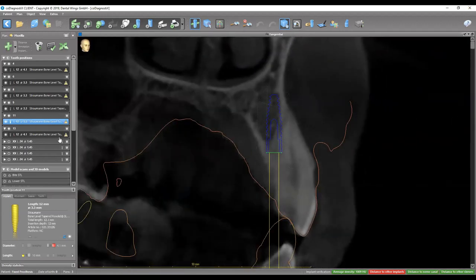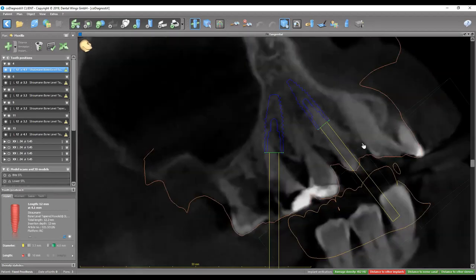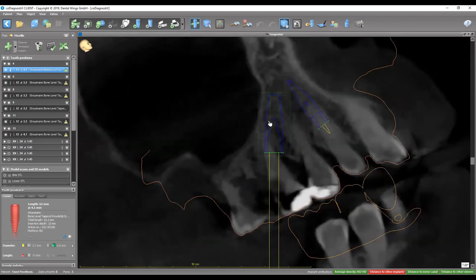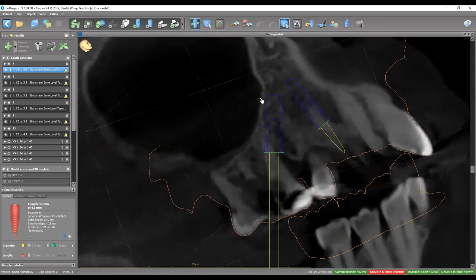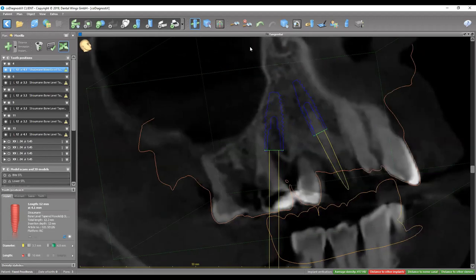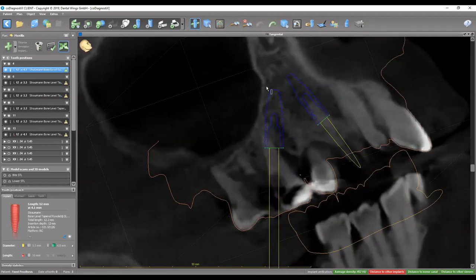Moving on to the distal ones — starting with the one on the patient's right side, number 4. This is the angled implant, a 4.1 by 12. I could even place a 4.8, as we'd usually want a bigger implant for the distally inclined ones. It is perfectly parallel to the long axis of the medial wall of the sinus — that's the 30-degree inclination. If you don't need that much inclination, you can tip the implant around 15 degrees more anteriorly. Even if we engage a bit of the cortical lining, it should be okay — that sometimes adds to the stability of the implant.